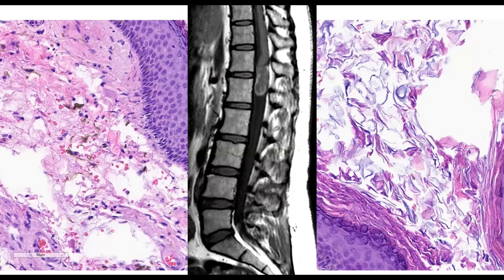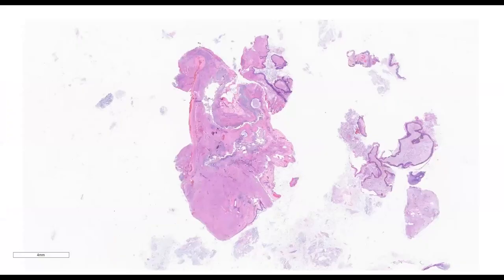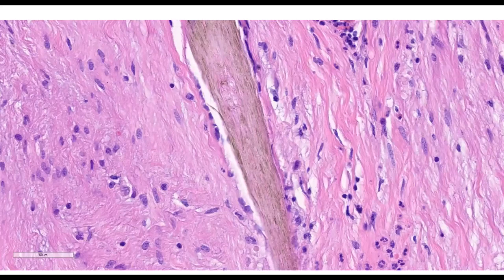Anyone? Maybe hemorrhage? It's fat. Okay. Explain it. Okay, that's okay. Here we go. Let's look. Now, I said there were four or five blocks. Four were only keratin. Look at this chunk of tissue here. Let's look at this chunk. That's a hair.